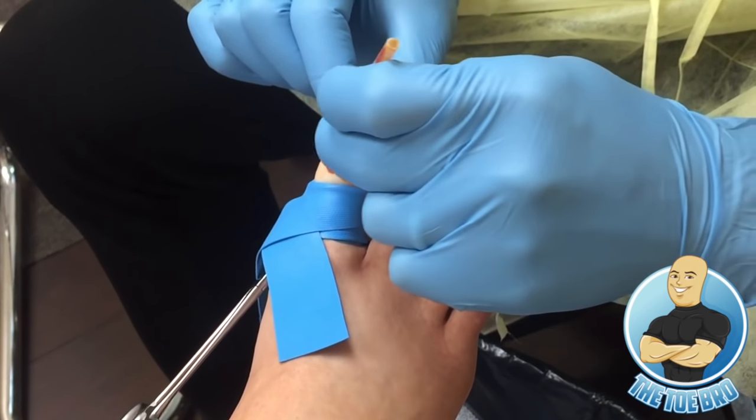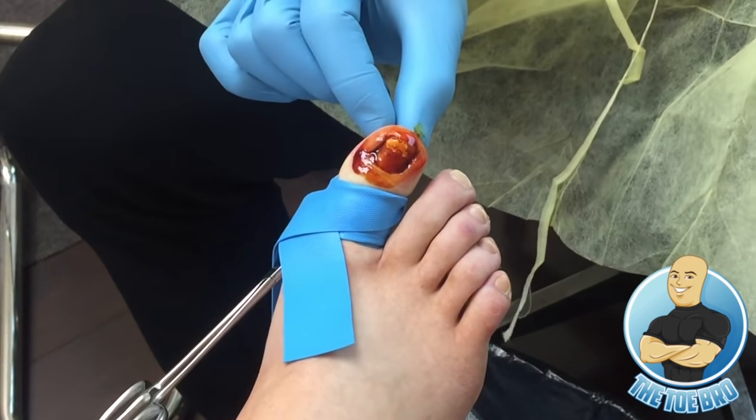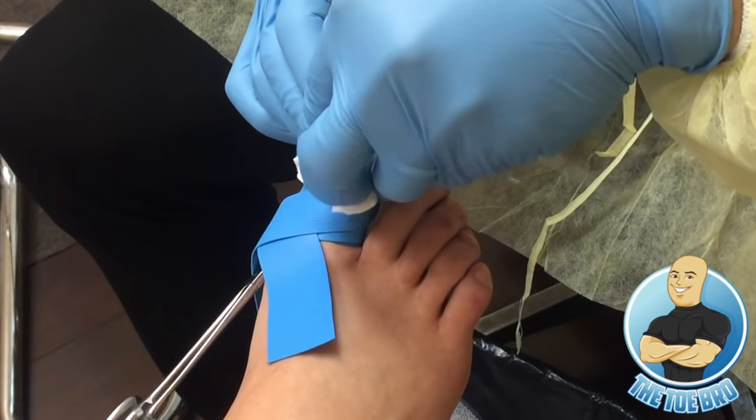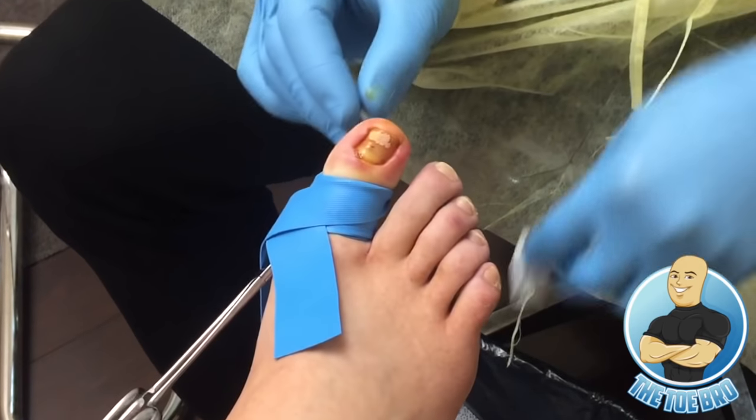And the last thing is we want to have a good field of view. The more blood there is in the field, the less we can see if we've removed all of the ingrown toenail, if there's any spike left behind.